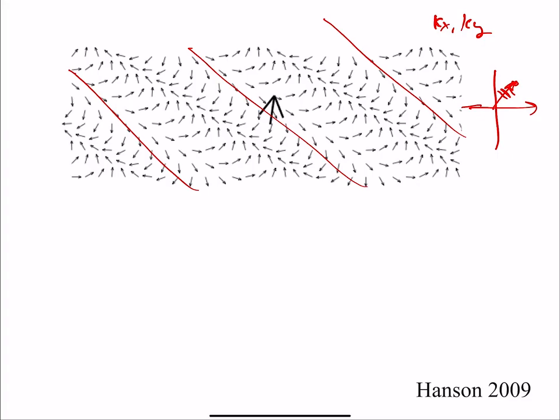So when I add up all those spins and do the vector sum, you'll notice a lot of these spins are going to cancel out, because they're pointing in different directions. And so when I add everything up, I get a relatively small sum, because it's not a good fit. So last time we talked about what would be a better fit: an object that had this sort of spatial pattern would be a better fit for this Fourier component.